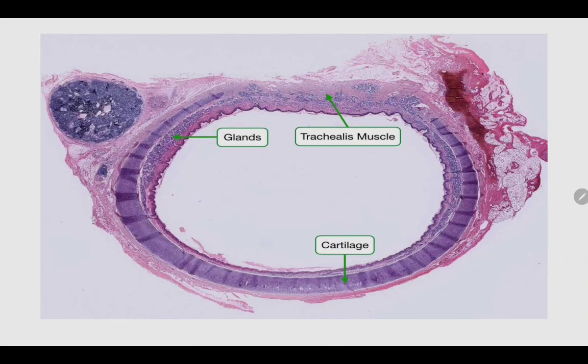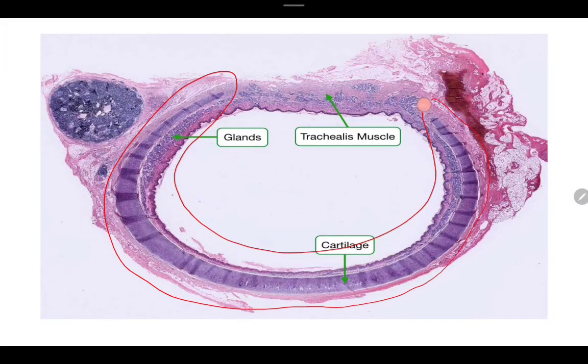So, this is an example of a trachea under the microscope that is being processed in the histopath laboratory. Can you appreciate the letter C structure of your cartilage? So these are all your cartilages. Your cartilage here provides framework and support sa imuhang trachea. So itong other parts dito, guys, we're not going to focus on that, but appreciate the picture or the structure of your cartilage. Okay, so let's move on to the next slide.